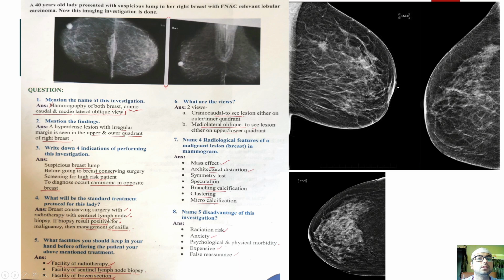So where will it be done? In the radiology department. So there should be a facility of radiotherapy, and there should be a facility of frozen section biopsy. To view the craniocaudal and mediolateral views, there are four radiological features here.